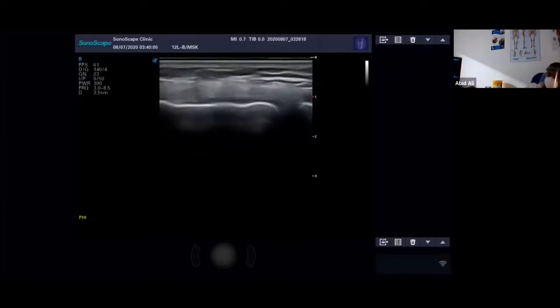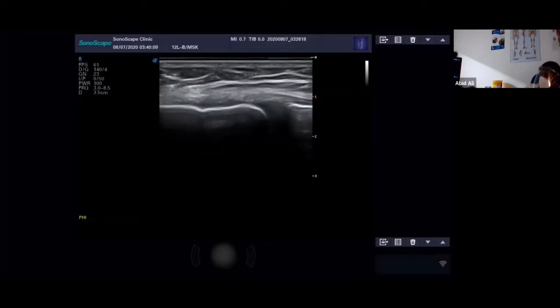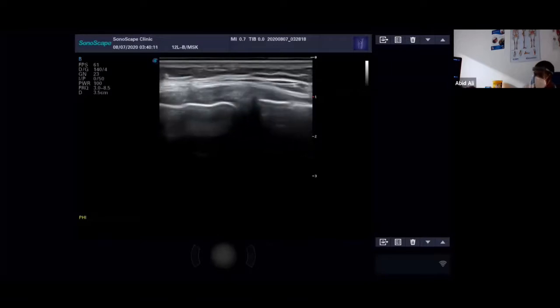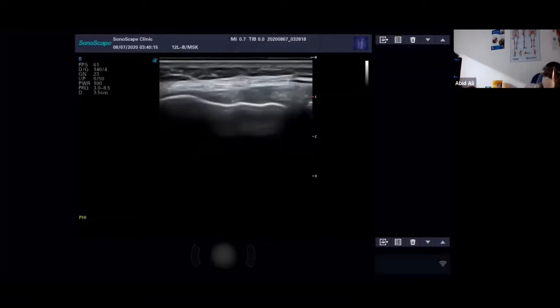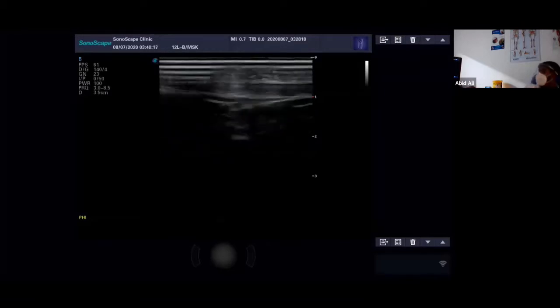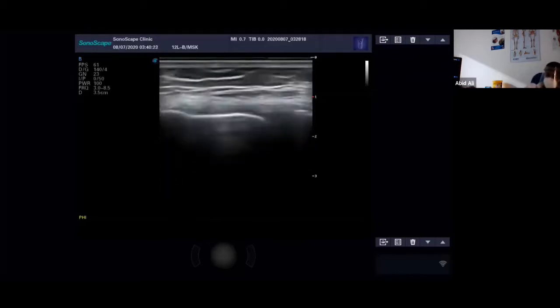If you do have a lot of fluid around the knee, it does make your visualization of the structures a lot easier. I tend to use it to look at the medial and lateral collaterals and the joint margin, and probably the patellar tendon for the most part, and for Baker's cysts, of course. It's just invaluable for that.